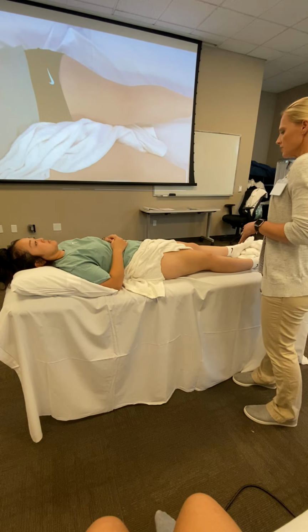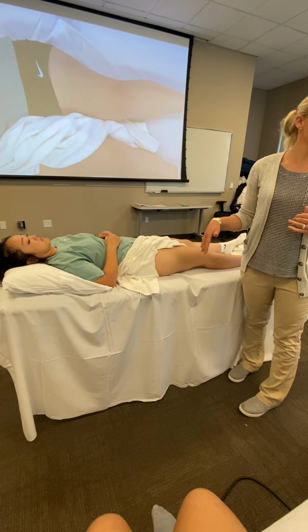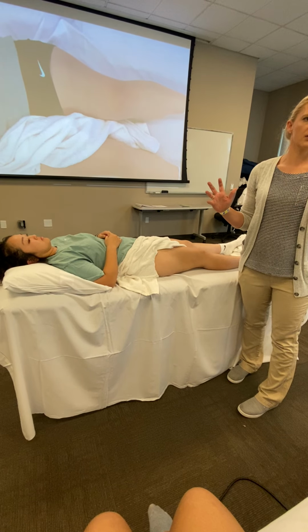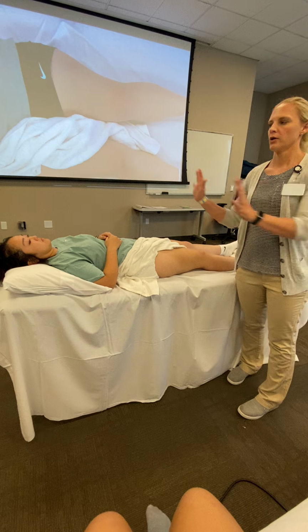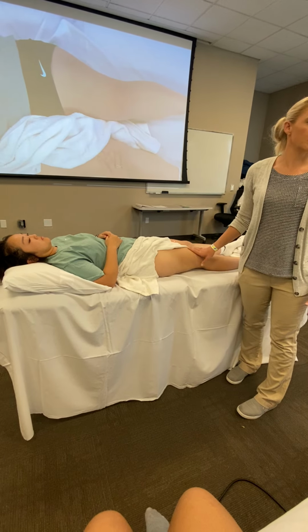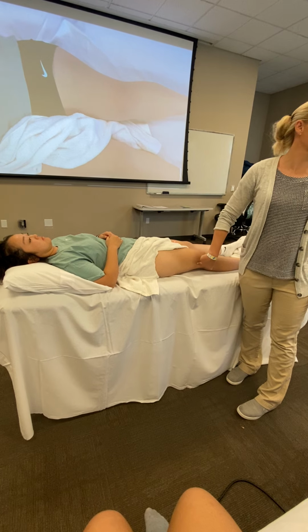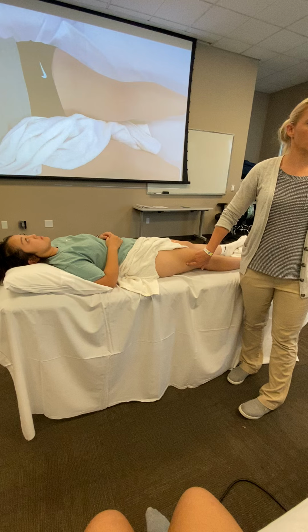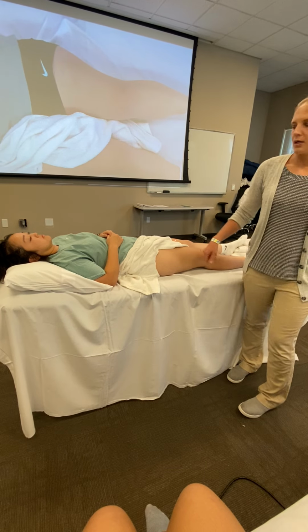So the table is actually gonna be doing most of the stabilization for the patient. You do wanna make sure that they're not going into a whole lot of posterior pelvic tilt and you're not rotating them away. This you are allowed to let the knee bend because you don't want the hamstring to be the limiting factor. We'll get to hamstring MLT later, but for goni, knee does get to bend.